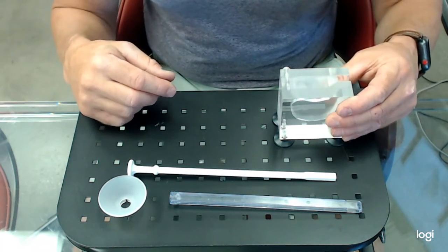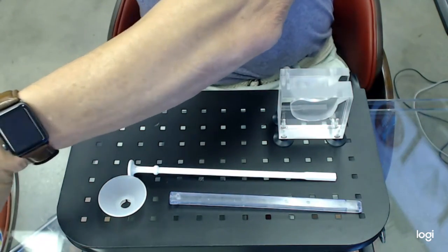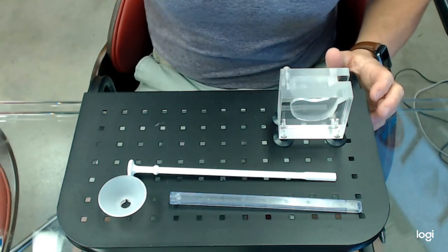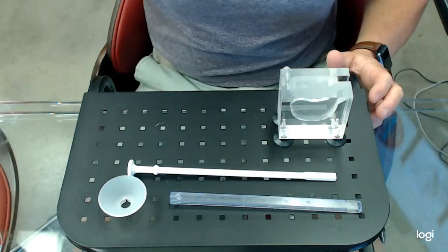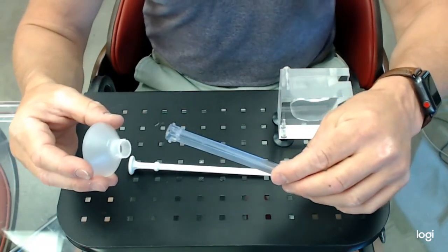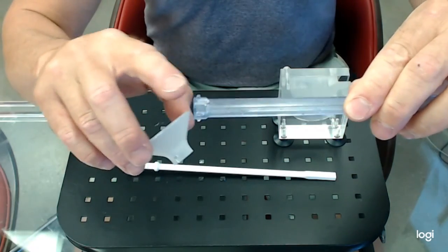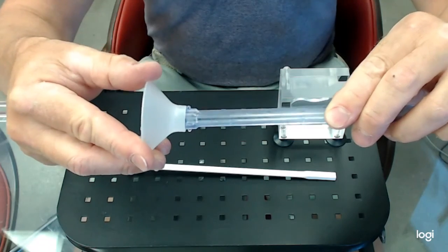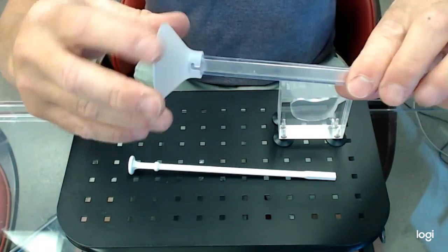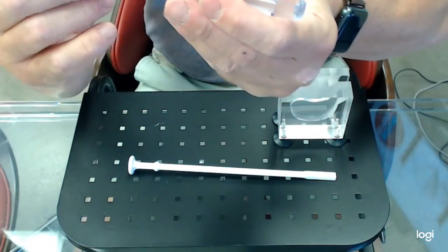And of course, the bone that you would collect when you're drilling away the hemilamina and the medial facet, that bone is going to be kept using the bone press, and this is what you're going to fill. So when you open it up, you're going to have these two pieces here. There's two little knobs here, and it goes right into those knobs, and then you turn it, and it actually engages into the top. So there's your funnel.